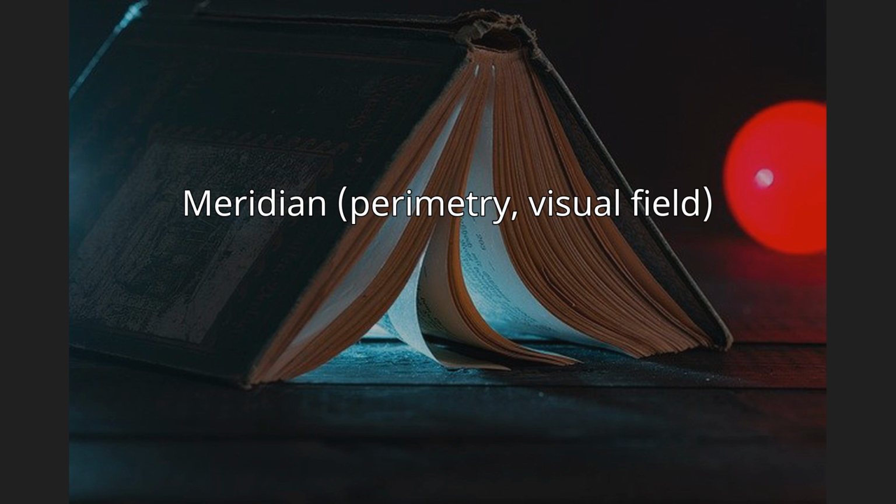The visual field is that portion of the external environment of the observer in which a stimulus can be seen when he or she is steadily fixating. In perimetry, the observer's eye is considered to be at the center of an imaginary sphere. More precisely, the center of the sphere is in the center of the pupil of the observer's eye. The observer is looking at a point, the fixation point, on the interior of the sphere. The visual field can be considered to be all parts of the sphere for which the observer can see a particular test stimulus.